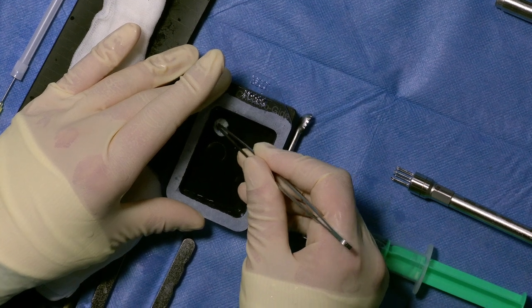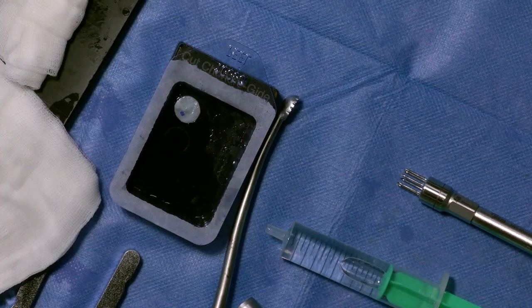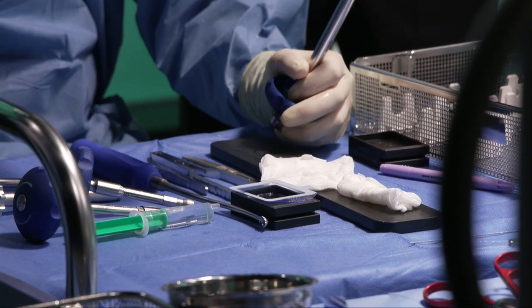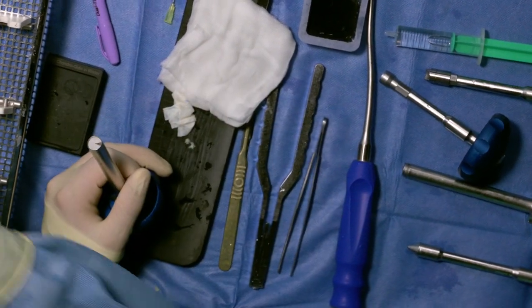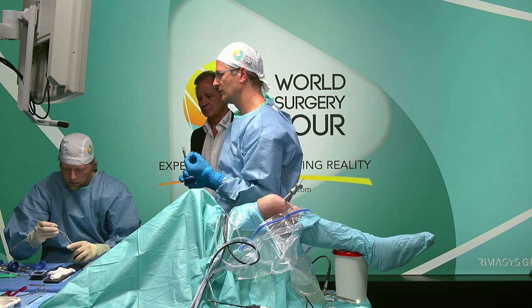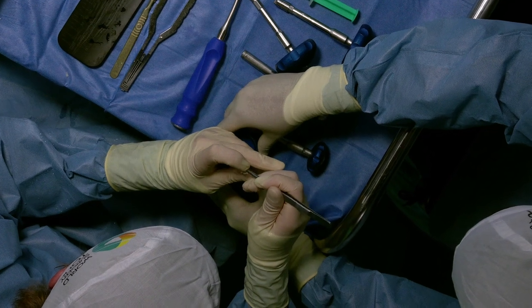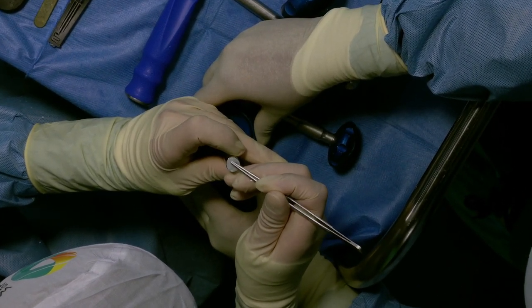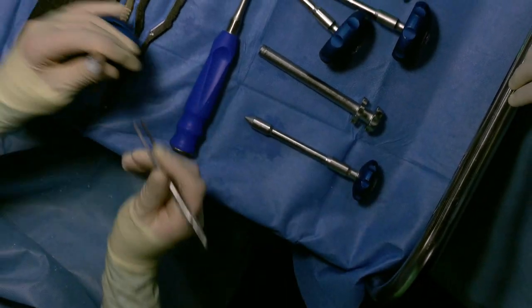So now, the next step is to make sure that we can put the membrane in the membrane inserter. And when I do this, I give these new instruments to Sven here. I will help you then. This is a multi-perforator for the subchondral bone. I can hand it to Sven already, okay. The idea about the microperforator is that the classic AMIC technique tries to use cells from the subchondral bone, which then would be covered by the membrane. So now you have both worlds, so to say. You have your autologous cartilage cells and the cells coming from the subchondral bone. In order to have the source from the bone, we need to put in the microperforator, which you're going to do right before. We then insert the membrane and the cells. Okay, can you hold it, please?